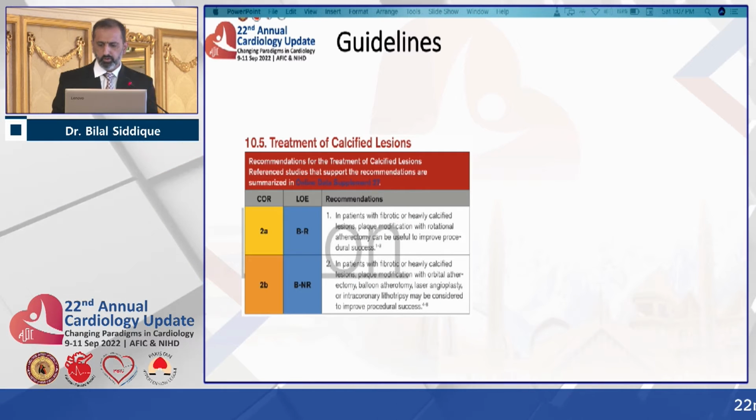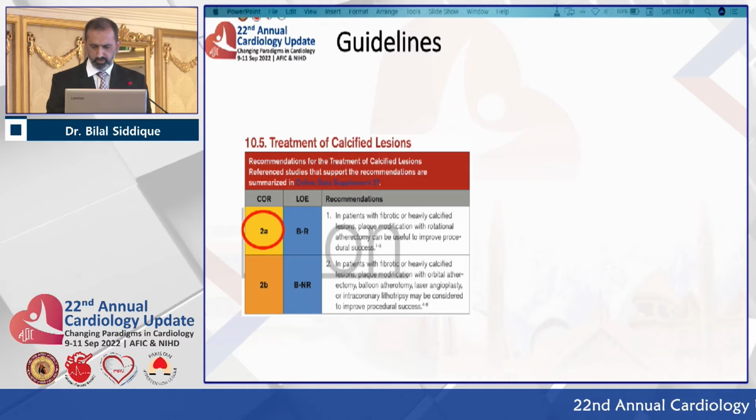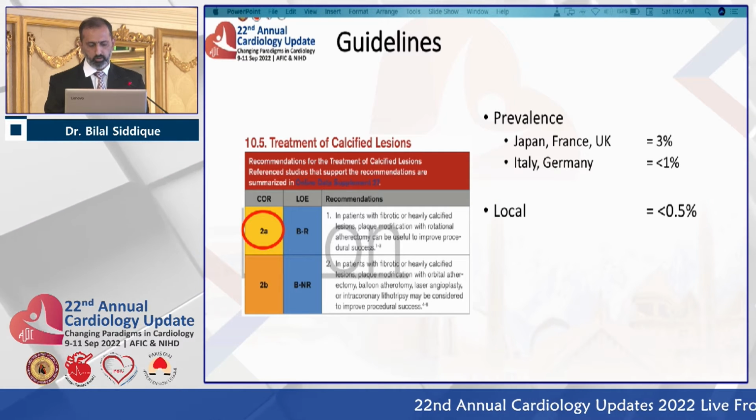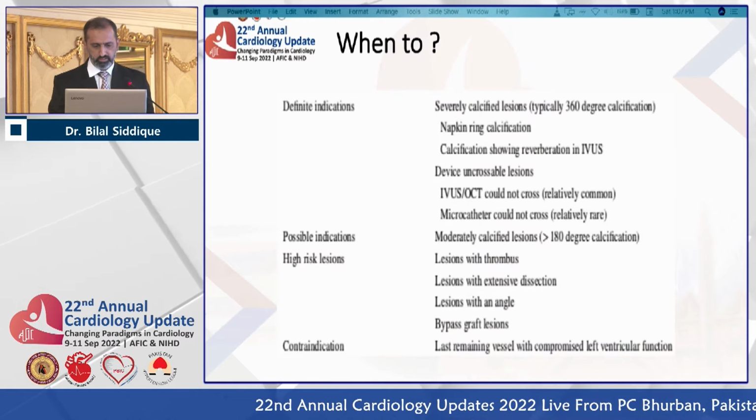Recently, guidelines give a two-way recommendation for heavily calcific lesions. However, its use still remains fairly low abroad, and locally also. There is no local data which exactly quantifies this; this is local data from our own hospital.